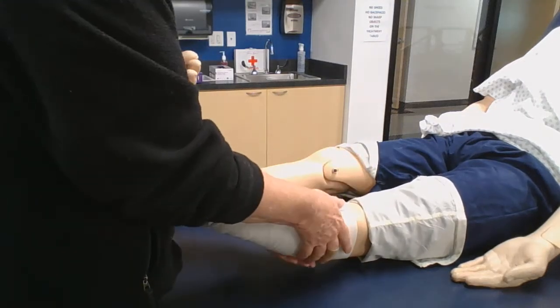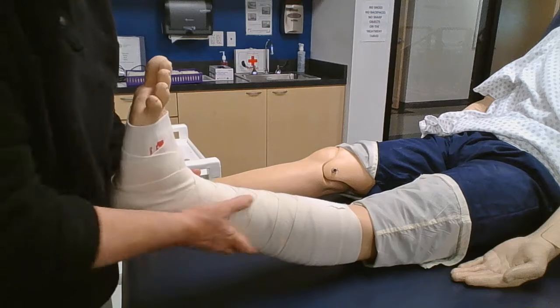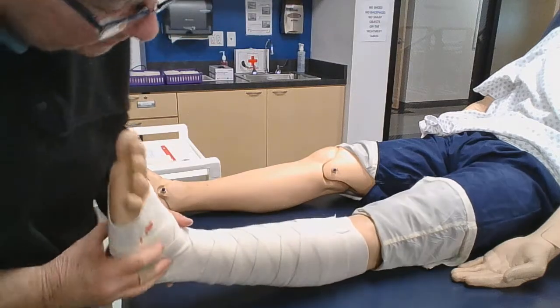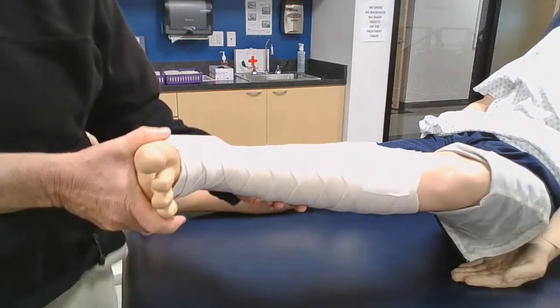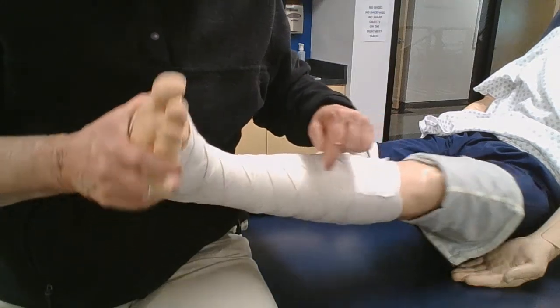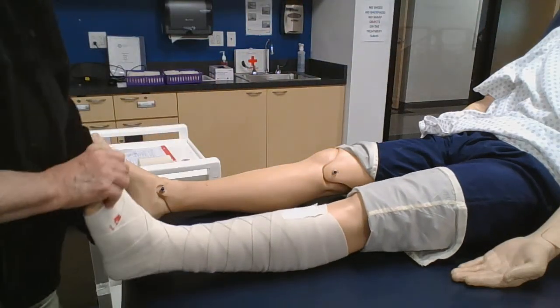Okay, we're going to get two nice pieces of tape on that, okay? So that doesn't pop off. Okay, so let me see if I can show you guys. I'm not sure you can really see that. I think you can kind of see that a little bit from the side. Let me do it this way. There you go. So you can kind of see how we've done that nice pattern all the way up here, both places here. We made sure that we got coverage.